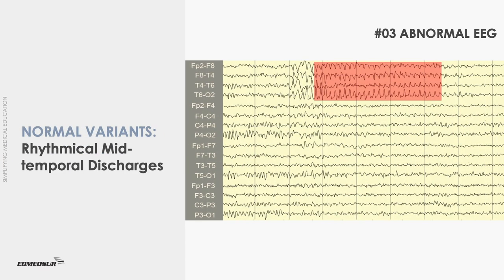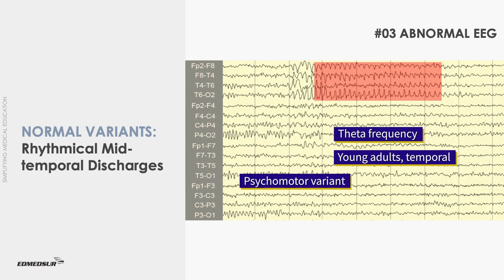Rhythmic mid-temporal discharges appear as bursts of rhythmical sharp waves which can have sharp, flat-topped, or notched appearance and last for a few seconds. They usually have theta frequency and variable amplitude. They are mostly seen in young adults during drowsiness in the temporal region, unilaterally or bilaterally in an independent manner.